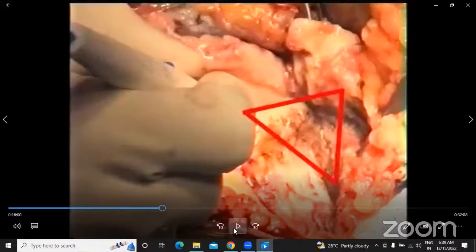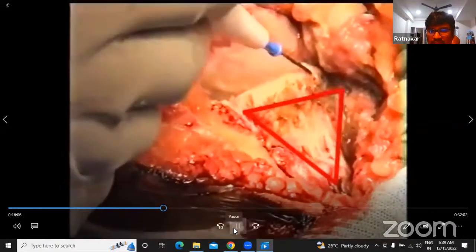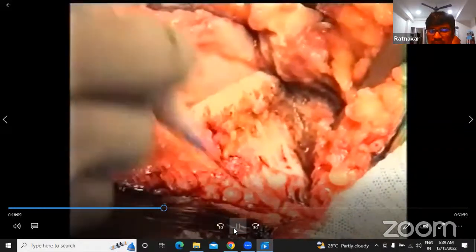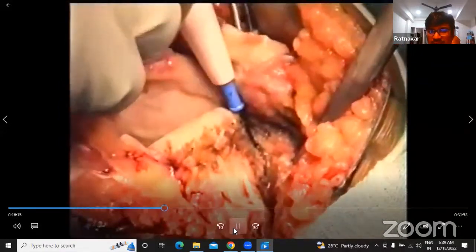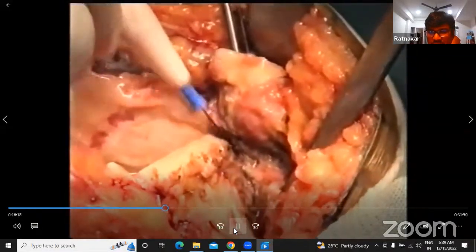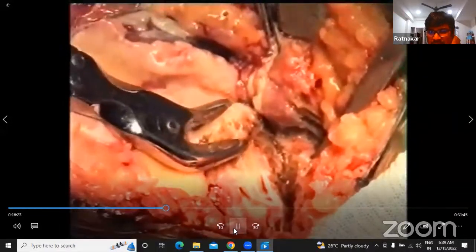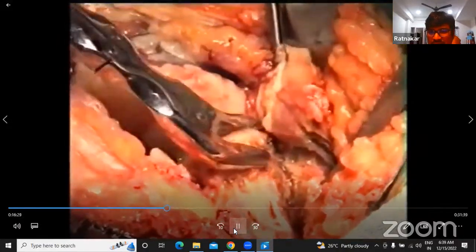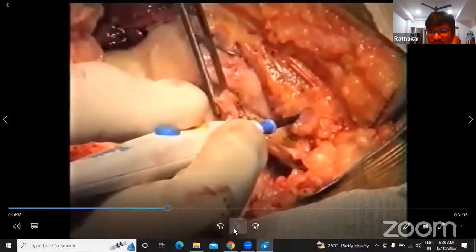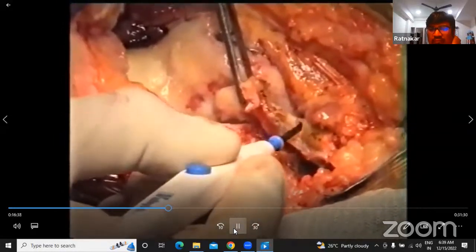That is the medial triangle of the upper tibia. Unless you see this, you should not progress to the next step. If the varus deformity is so severe, you have to go further backwards and release the posterior medial aspect of the tibia as well. The osteophytes here on the upper part of the tibia, these all will make a lot of difference. So you have to take them out now. Go right up to the periphery, then you might even cut the collateral ligament. So always cut into the meniscus, then you are safe.